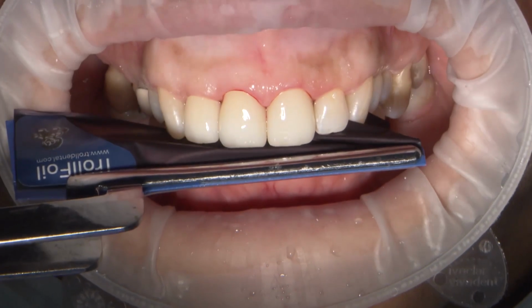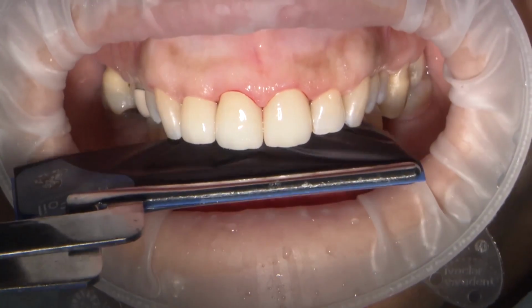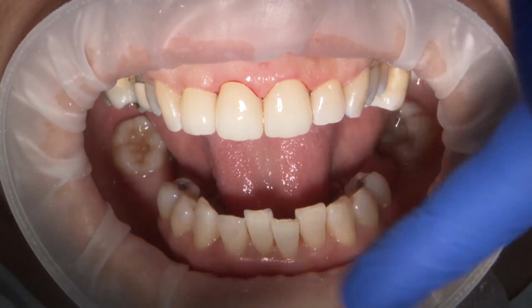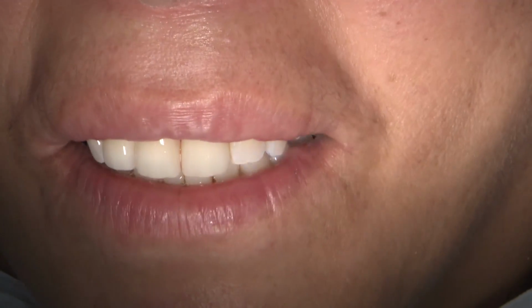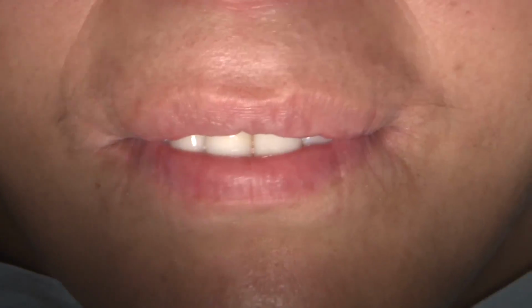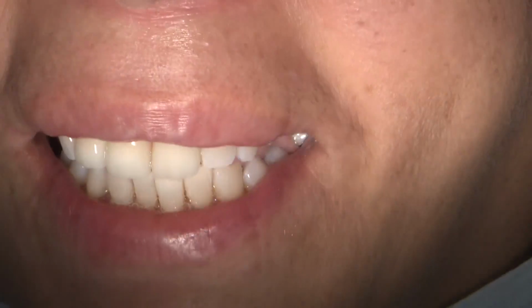After removing the excess cement, I check the occlusion and phonetics to make sure there will be no interferences. I check for the F sound and confirm the incisal edge is in ideal position, and there is no lisp when I check for the S sound.